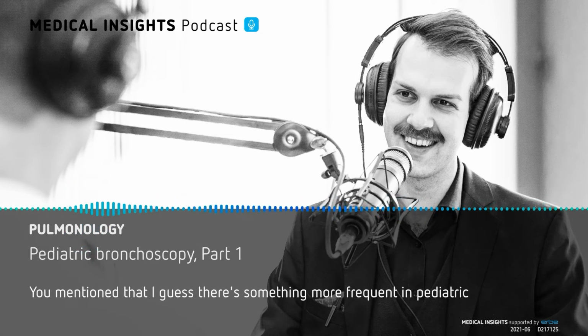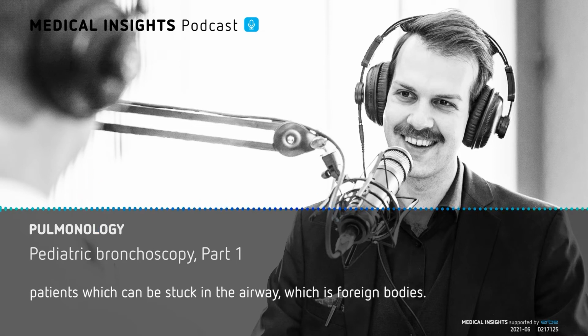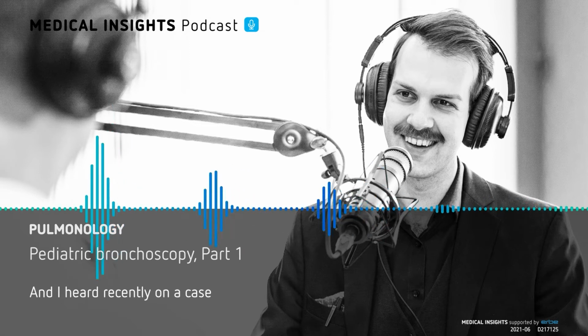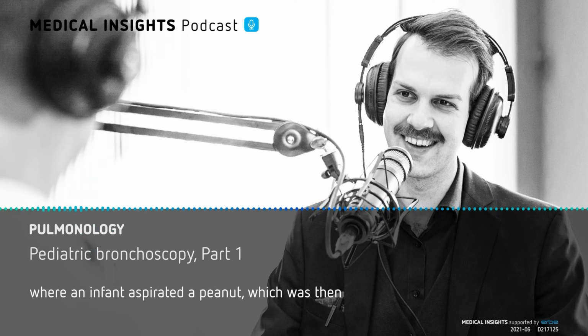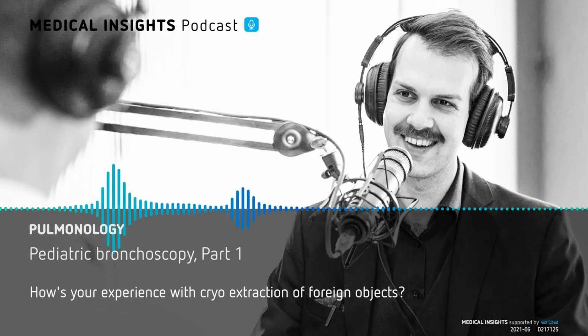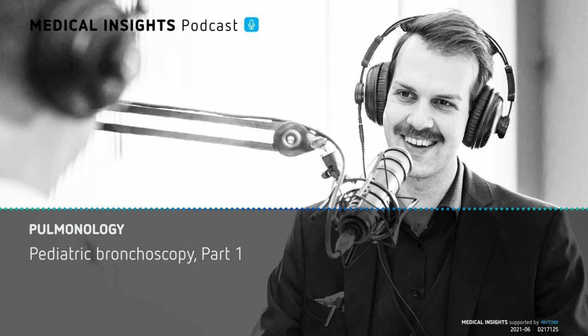Speaking of other things in the airway than blood clots, you mentioned that there's something more frequent in pediatric patients which can be stuck in the airway, which is foreign bodies. And I heard recently of a case where an infant aspirated a peanut, which was then removed with cryo extraction. How's your experience with cryo extraction of foreign objects?